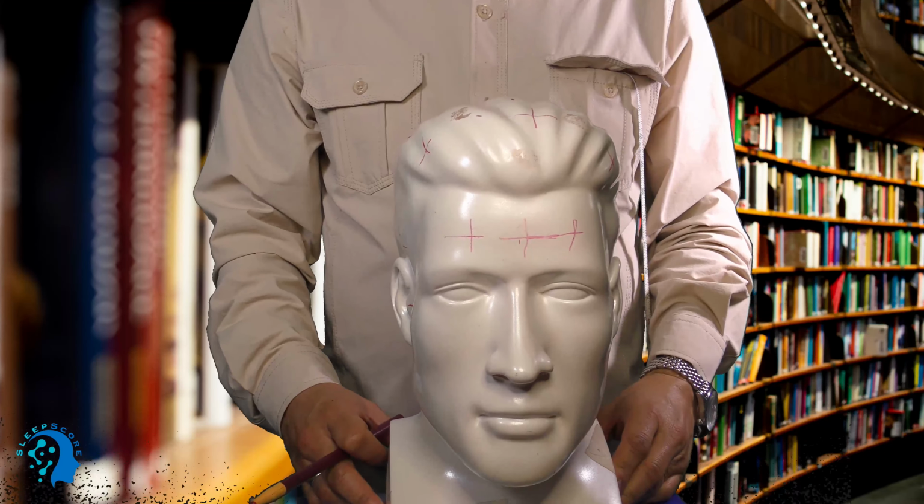Now check it out. I take the centimeter side. Then I go from Nasion to Inion and measure half, mark half. I go 10% here, and 10% on the other side also.